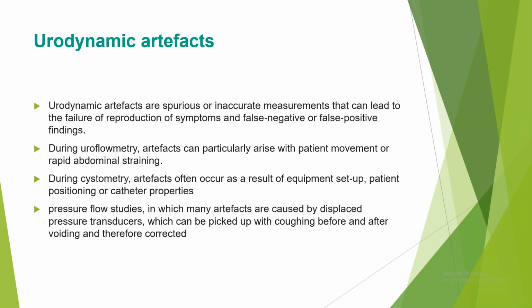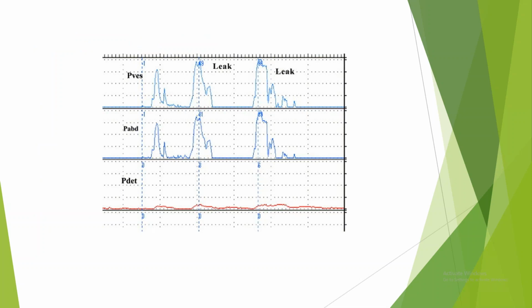So now, Mridula, in this graph, where is the leak shown here? See, they have not given any flow. How are you going to demonstrate the leak here? They have only written that it is a leak. Flow graph is not there, they have not mentioned it anywhere. They've written leak above there, only because they have not given a flow graph. If the flow graph is given, we have to identify the leak. Okay.